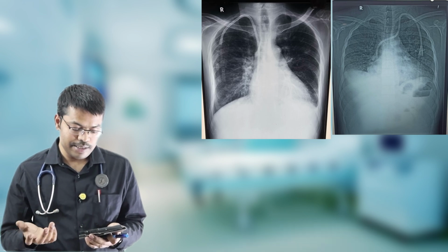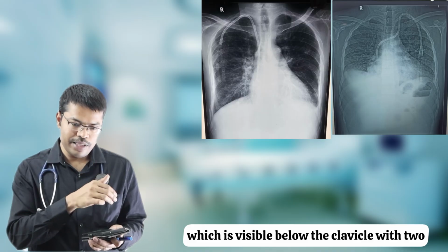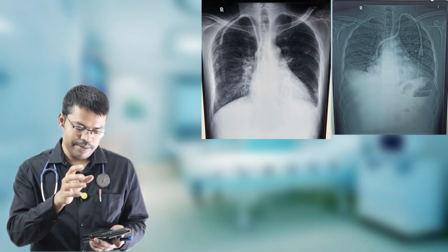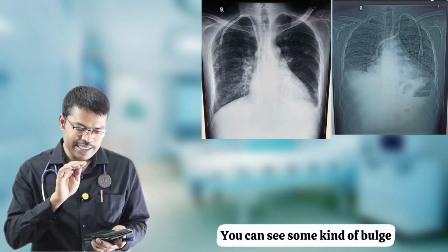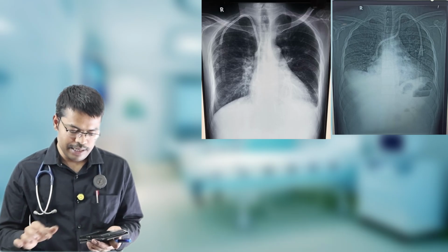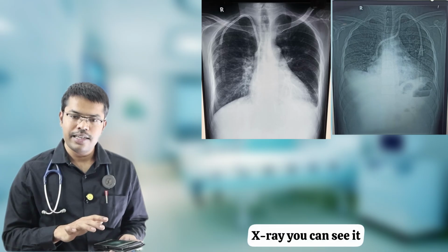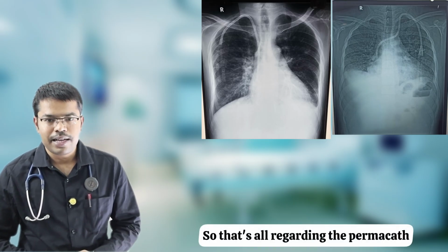Externally how it appears, the patient will only have a catheter which is visible below the clavicle with the two sides, arterial side and venous side, but the catheter will be only in the vein. You can see some kind of bulge. The catheter will produce some kind of bulge. That's all you can see. Nothing more you can see in the patient externally. X-ray, you can see it. So that's all regarding the Permacath.